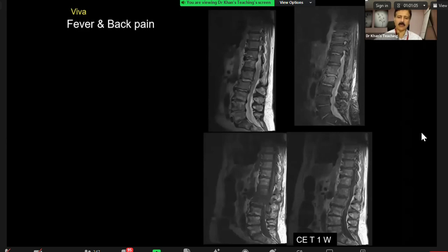In head and neck, it's a very important exam or viva question: a subperiosteal abscess of the ethmoid sinus. The clinicians will ask, is there an orbital abscess or not? And if it is a phlegmon, you just tell them that it is not drainable. So the basic concept is, just remember that phlegmon is inflammatory tissue which enhances. When there is pus formation, that is an abscess, and by definition, pus will be liquefied. There will be surrounding enhancement, but the pus will not enhance.